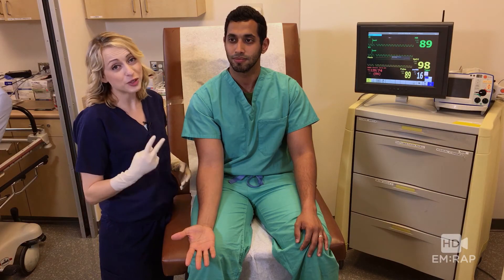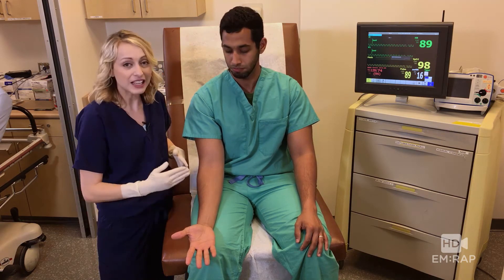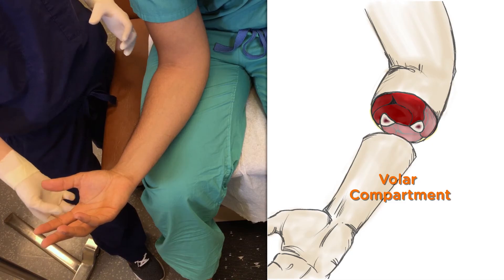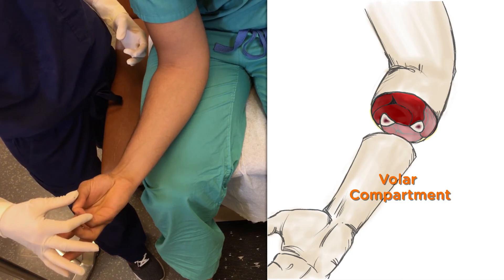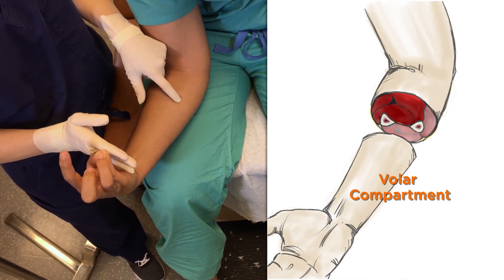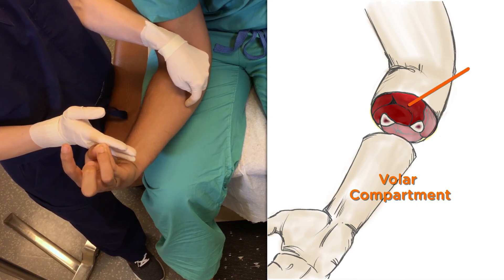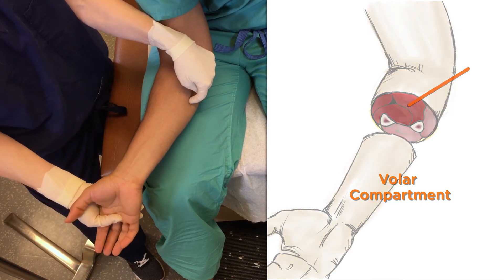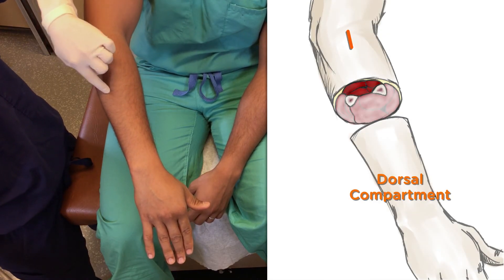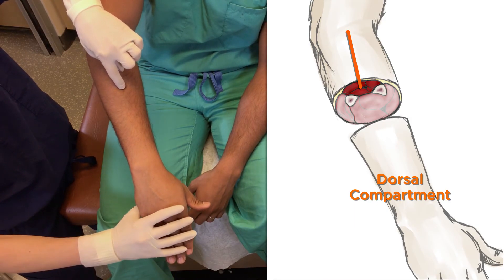The forearm has two main compartments — the common ones we're going to focus on. For both of these, you're going about one-third the way down the forearm. For the volar compartment, position the patient like they're doing an arm curl, then have them oppose their thumb and small finger and flex against resistance. Track that palmaris longus tendon up and insert the needle just medial to this point, aiming towards the ulna. Go one to two centimeters deep and the pressure rises with extension of the wrist. To find the dorsal compartment, have the patient palm down and palpate the ulna. Go one centimeter towards the radius and insert the needle one to two centimeters deep. The pressure rises with flexion at the wrist.